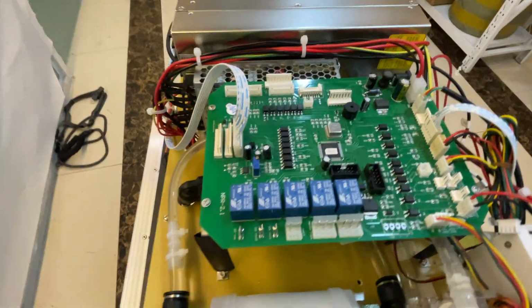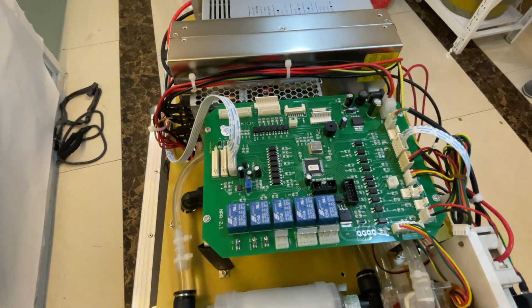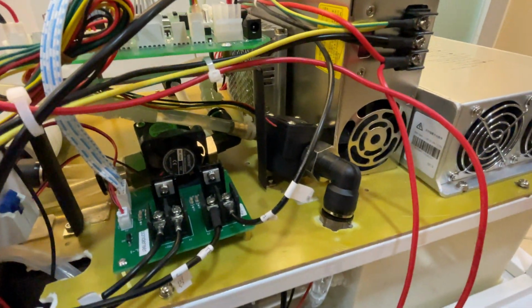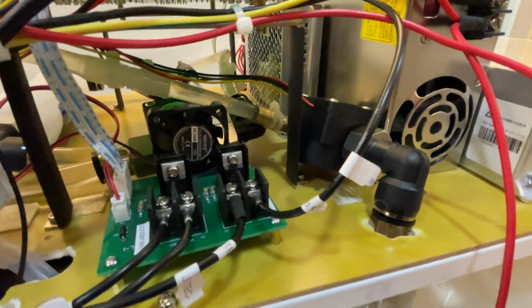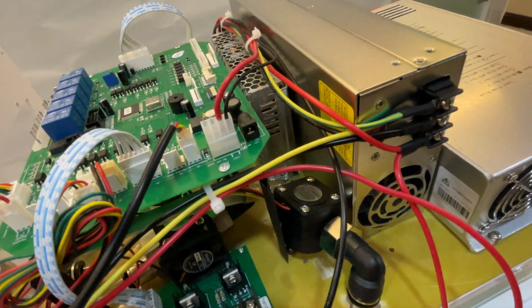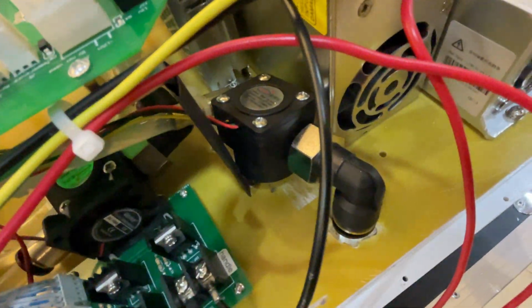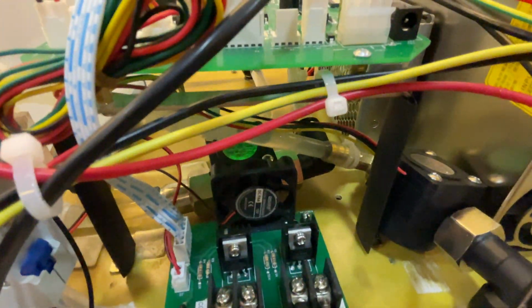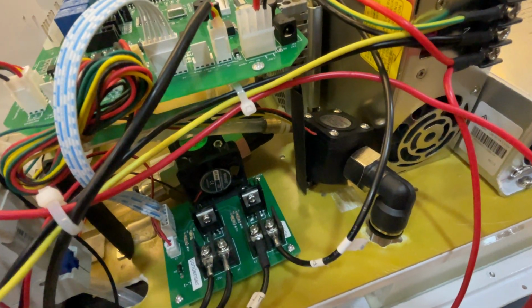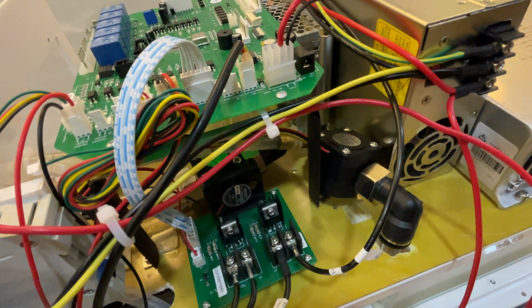Next, this is the control board. Then the flow sensor, a four-wire flow sensor. The second one is identical, but I only use three wires; the other wire is unused. One flow sensor, the second flow sensor. The reason is like the two engines of the plane. When both of the flow sensors are broken, the menu shows the error signal.